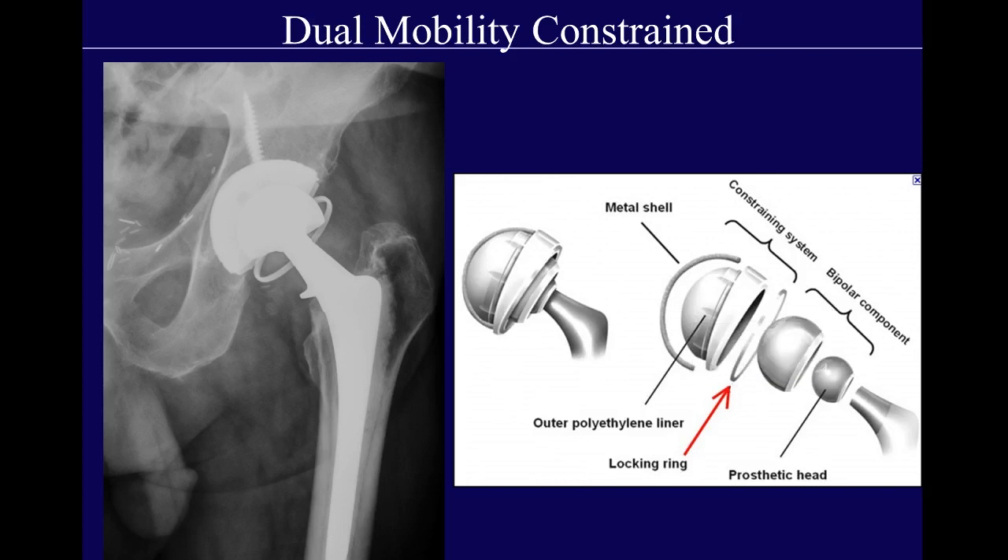You can also constrain a dual mobility bearing. In this diagram from the literature, the femoral head articulates with an inner cup, and that inner cup is locked into an outer cup by a locking ring. In one of my cases, you can see the neck, the head, and the inner cup locked into the outer cup — articulation across two different bearing surfaces, locked into each other, to decrease the rate of dislocation.